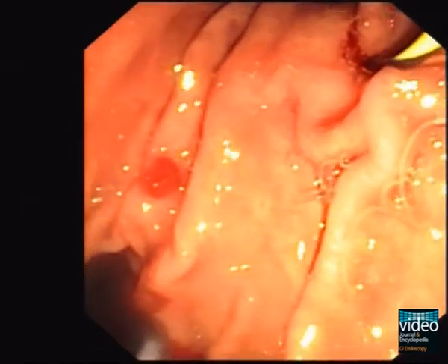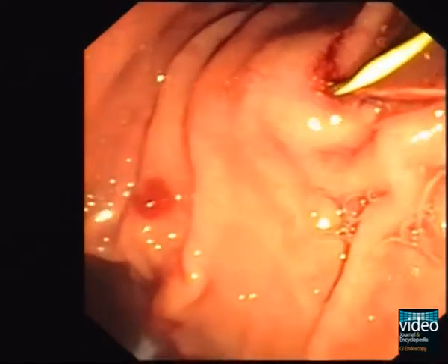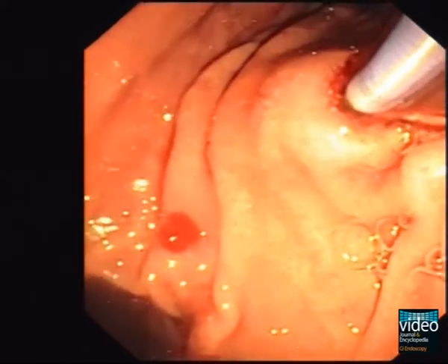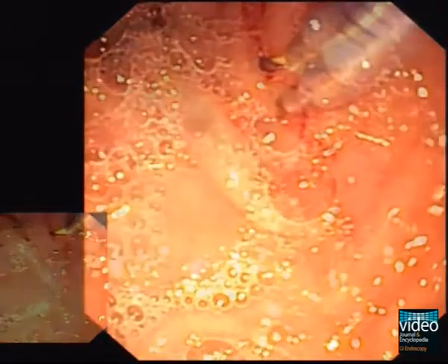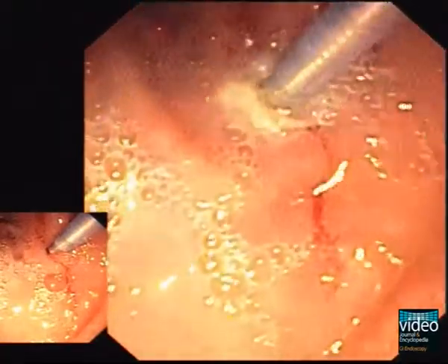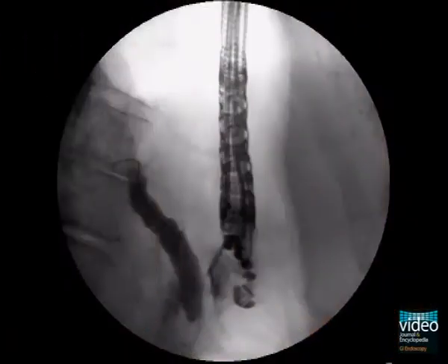Under endoscopic control, a high-frequency ring knife is pushed forward over the guidewire up to the gastric wall. With the ring knife and concentric cauterization, an opening — a so-called gastropancreatic ostomy — is created.